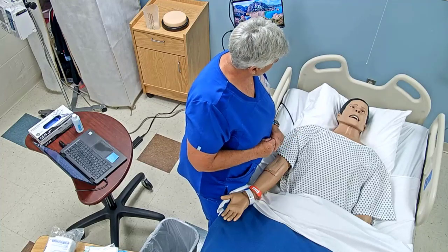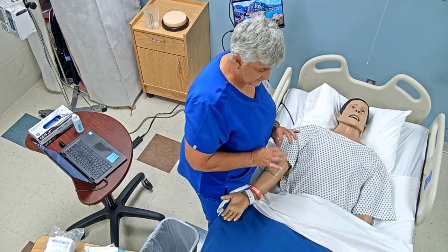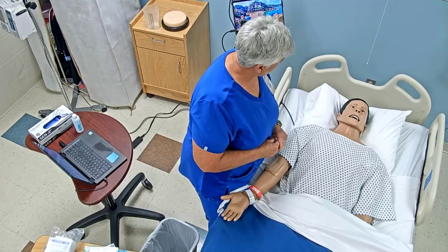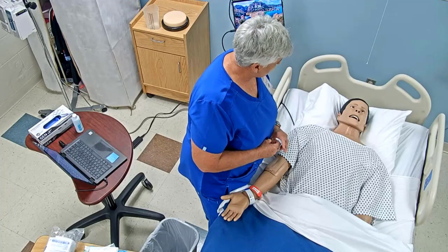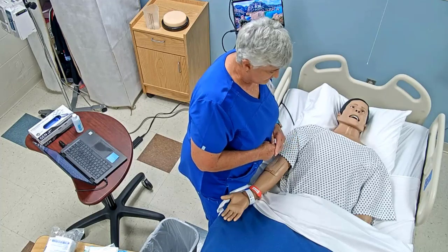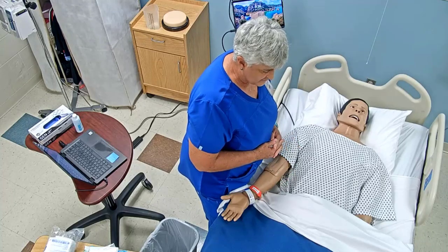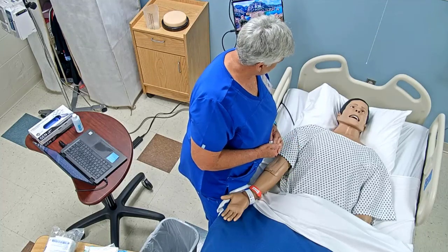It may feel a little uncomfortable, but we're going to drain it into a bag, and afterwards I'm going to take a specimen from that bag so we can send it down to see if you have any infection, and if you do, what kind, so the doctor knows what antibiotic to put you on.